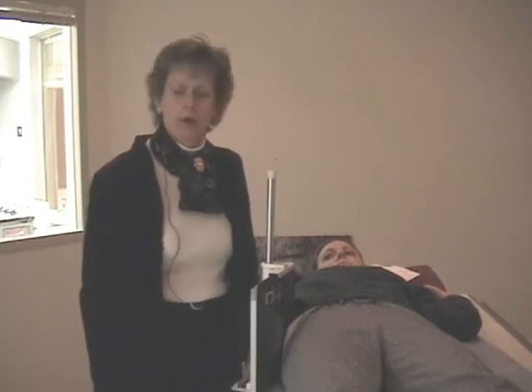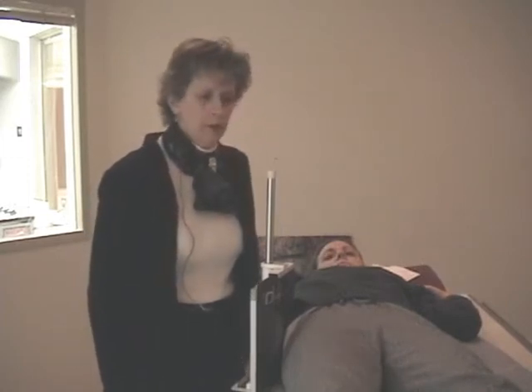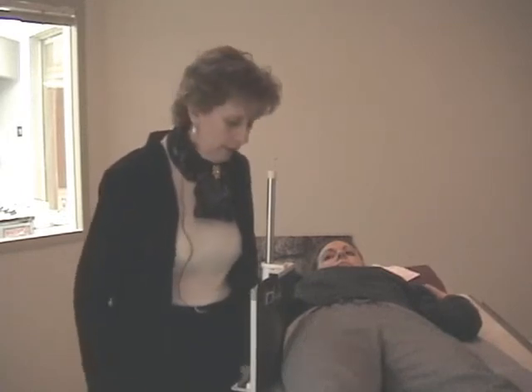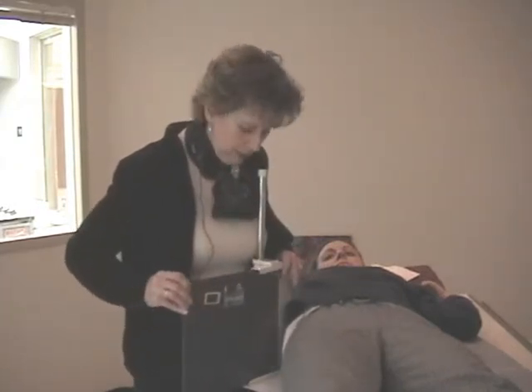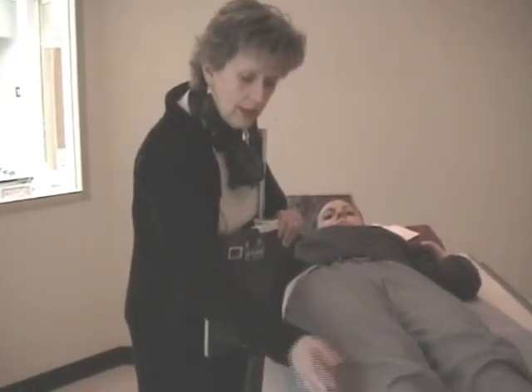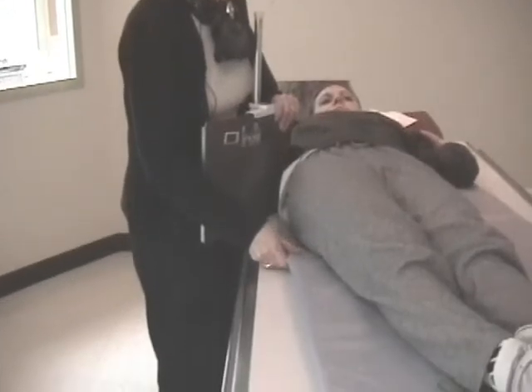We've realigned the camera for a better view of the cross-table lateral, and we've pretty much set the patient up, again, for demonstration purposes. So I'm going to tell you what we've done here. I have a 10 by 12 cassette with a grid set up here. The patient is lying, can you move your leg, Jacqueline? The patient is up on a sponge, okay? You can take a look there.